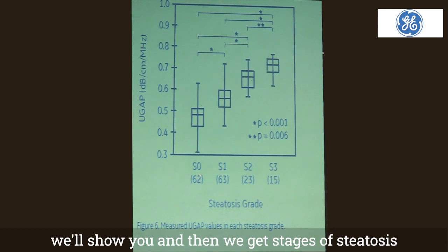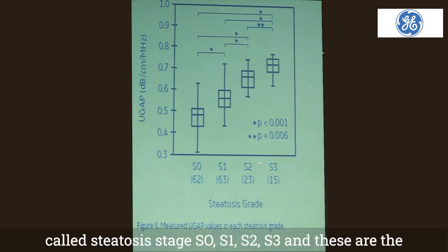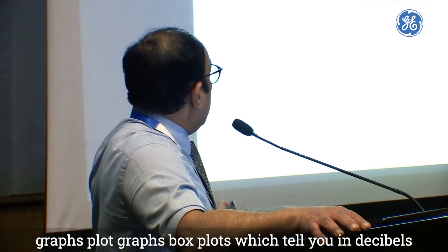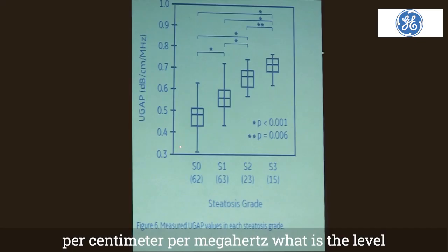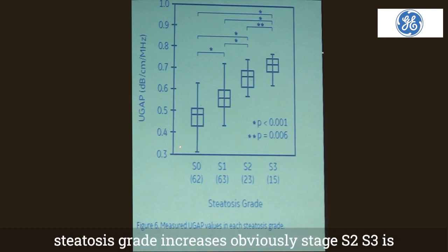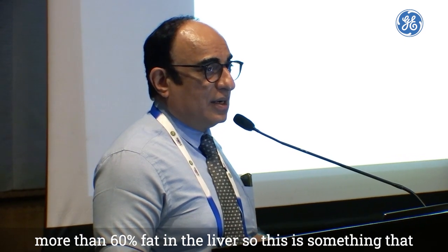And then we get stages of steatosis. So we have a more objective method now. It's called steatosis stage S0, S1, S2, S3. And these are the box plots, which tell you in decibels per centimeter per megahertz what the level of steatosis is. As the attenuation increases, your steatosis grade increases. Obviously, stage S2, S3 is more than 60% fat in the liver.